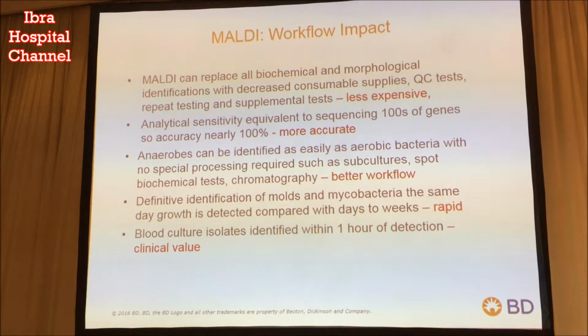And then finally, we were able to do tests directly from positive blood cultures, and we would have the identification of the organism in less than an hour from when it was first seen in a positive blood culture. So again, it totally transformed the way we were doing microbiology in the clinical laboratory. And that's why the comments that this is a research tool and wouldn't be used in a microbiology lab seem a bit ludicrous today.